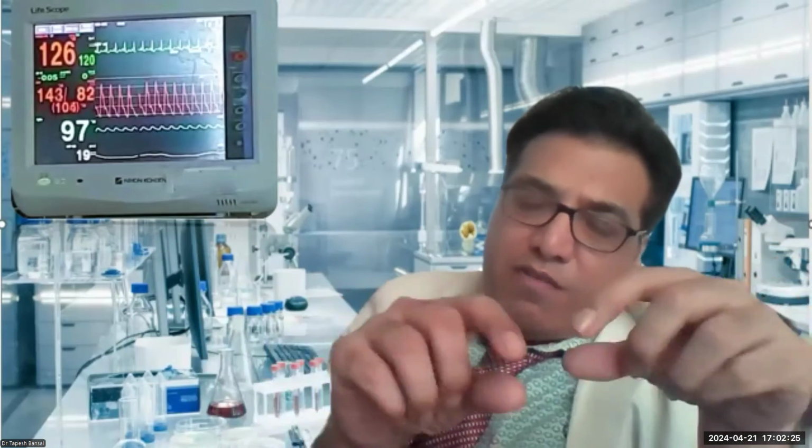Very important is that there's an airflow coming in, and this airflow is continuous during expiration and inspiration. And if the patient's respiratory effort is weak, he can go into an apnea alarm because his respiration is weak and he has to draw air against this continuous source of air, right? So he's unable to trigger the ventilator, and he can go into an apnea. So one has to be very careful.